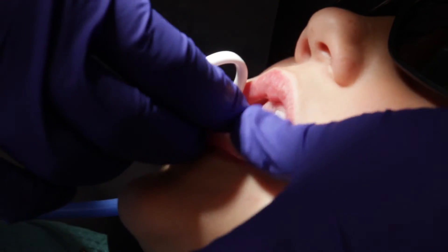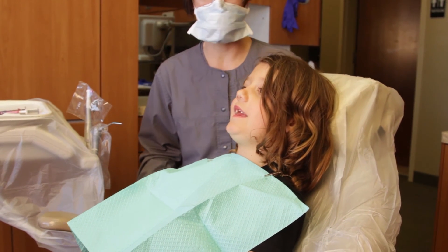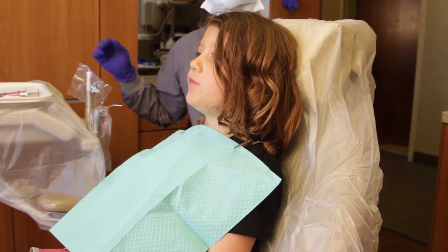If working on a lower molar, place a cotton roll between the tongue and the molar. This is how the BlueBoa can assist you with tooth isolation for sealant placement.